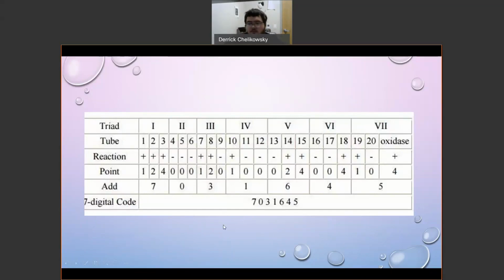Now then, we are going to do a hypothetical here, so that I can show you how to use these books. Let me pull up my annotation here. Our API code, as I am really bad at this, is going to be 0044040. Our Enteropluri code is going to be 41100. Nobody has these. Well, may not have these. When we look at the Enteropluri, I'll explain what I mean by that.